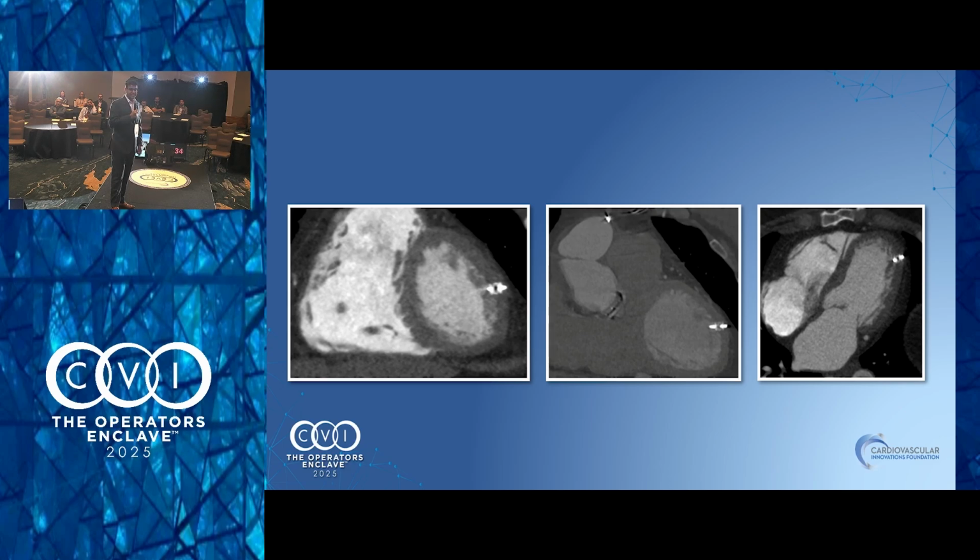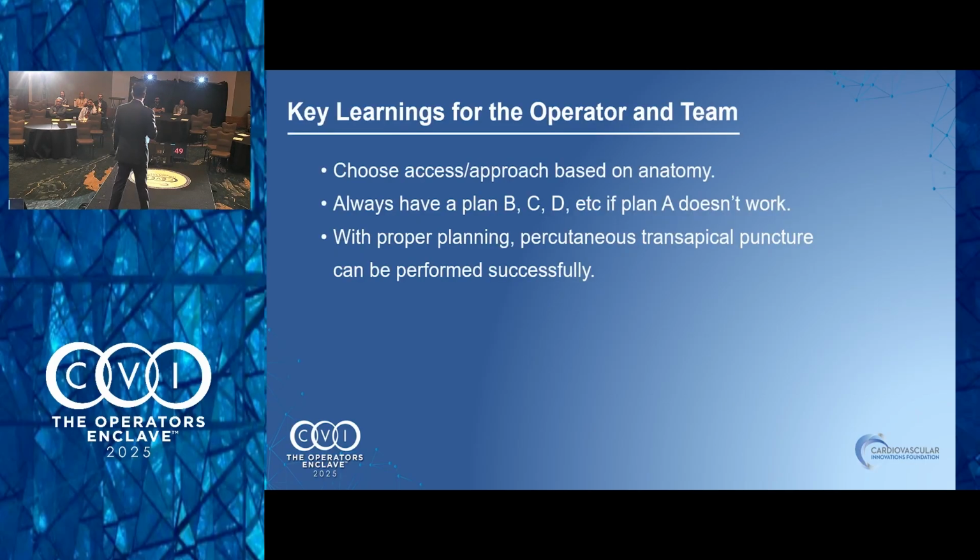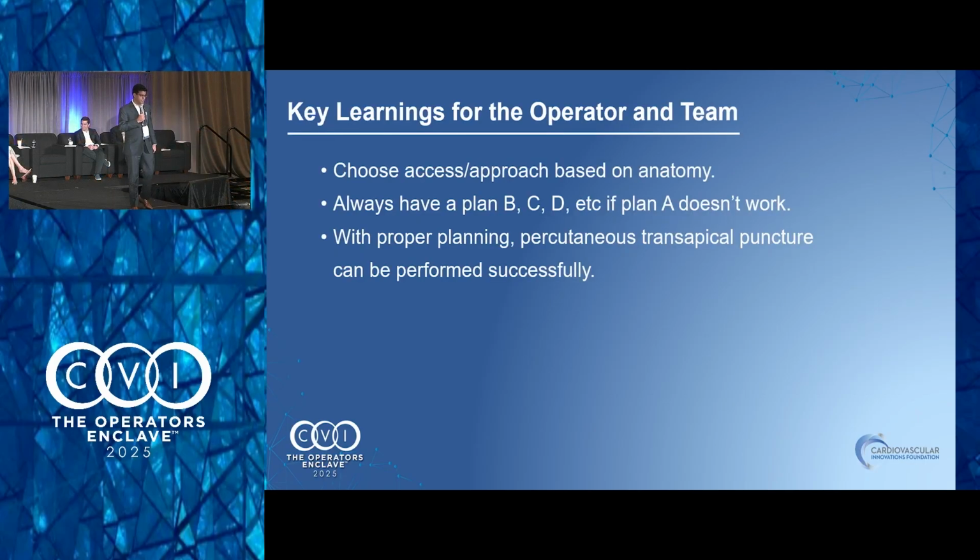Good, you missed the LAD. Yeah. At least when we did transapicals at Mayo, Jerry always said the LAD never comes to the apex. Actually, it comes to the side around it. So that's why we want to be at the apex. So we were fortunate here. We didn't touch anything.